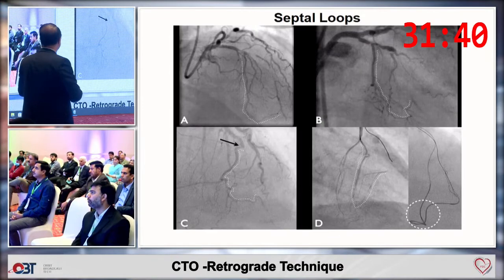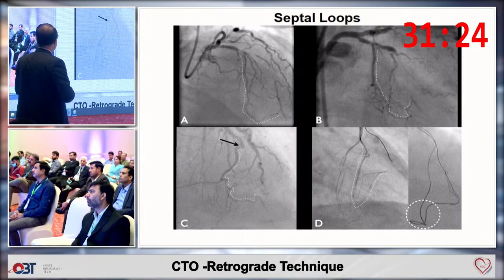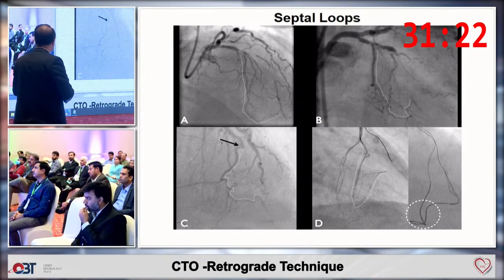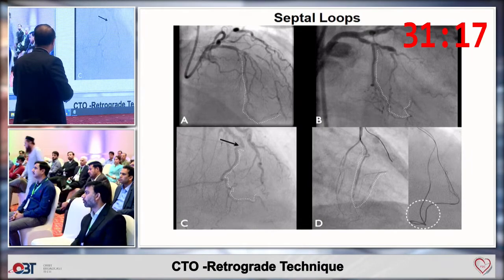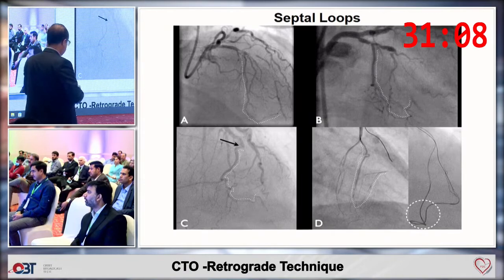So you can have septal loops. This is a septal loop connecting to the distal LAD. So these are ipsilateral collaterals. You can come through this collateral, go back into the LAD and do a retrograde PCI. Again, these are collaterals from LAD to the LAD. And this is a very tortuous septal loop here, you can see.